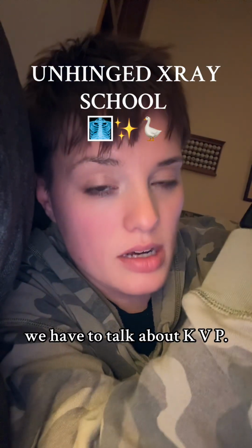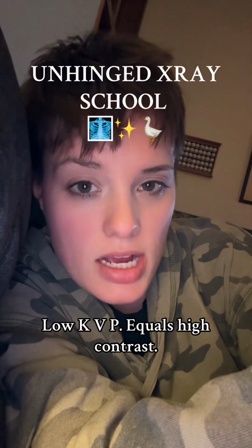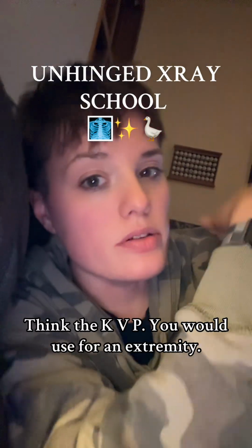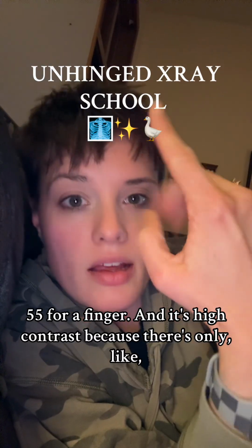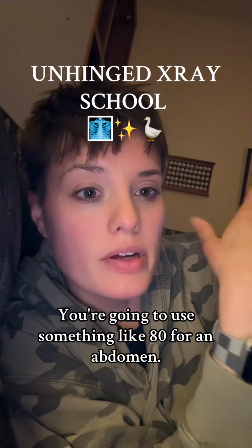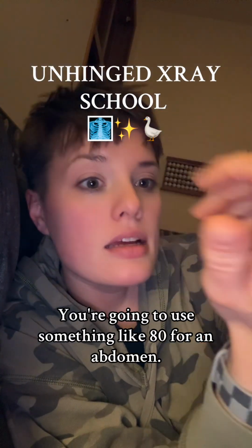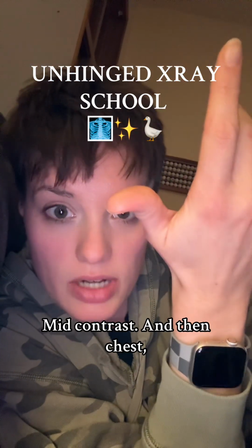And then, of course, we have to talk about KVP. Low KVP equals high contrast. Think the KVP you would use for an extremity. You would use like 50, 55 for a finger. And it's high contrast because there's only like bone and skin in here. You're going to use something like 80 for an abdomen, mid contrast.